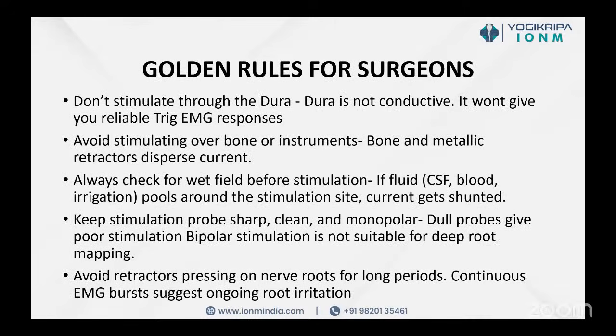What are the golden rules for the surgeons? When you are using the probe to check the pedicle screws, do not stimulate through the dura, because dura is not conductive. It won't give you a reliable triggered EMG response. Even during the pedicle probing and checking, do not stimulate the dura. Avoid stimulating over the bone or instruments because bone and metallic retractors disperse the current.